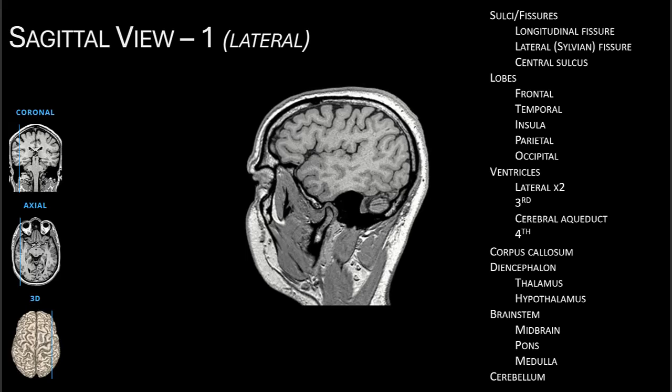Let's look at these features on a sagittal plane, starting the most laterally, then moving directly to the mid-sagittal view. In this very lateral sagittal view, similar to a diagram from a textbook, we can see the lobes: the frontal, temporal, parietal, and occipital. Between the frontal and temporal lobe we see the lateral fissure, also called the sylvian fissure. Between the frontal and parietal lobes is the central sulcus. Finally, at the posterior inferior region, we can see the lateral surface of the cerebellum.